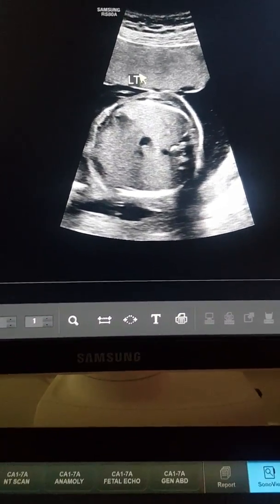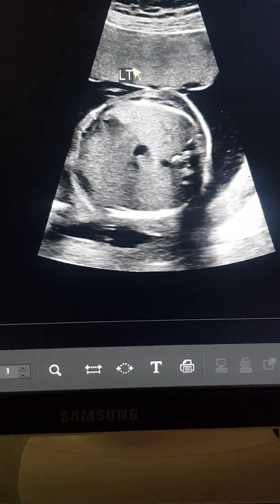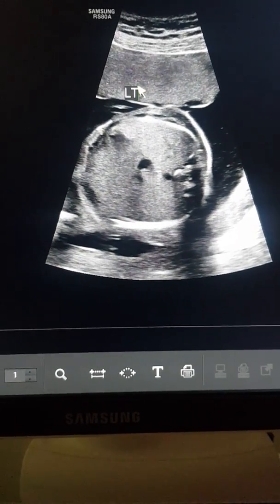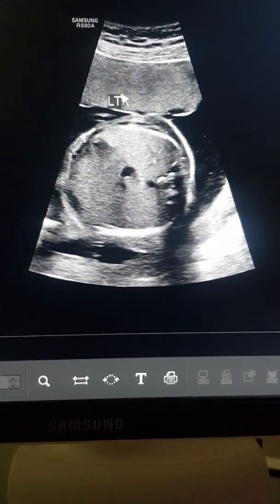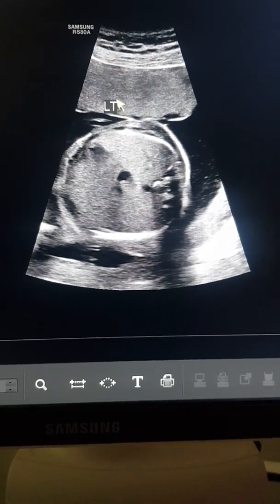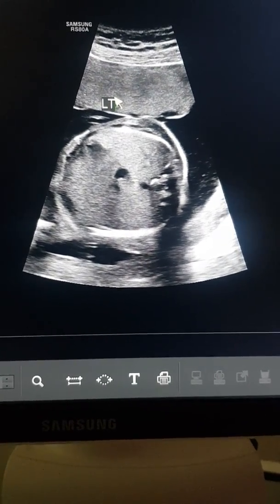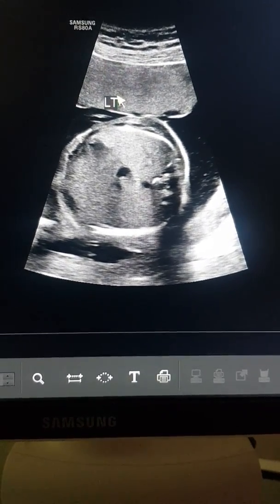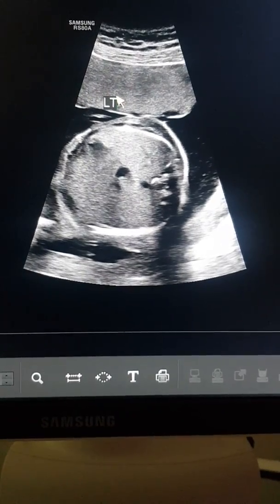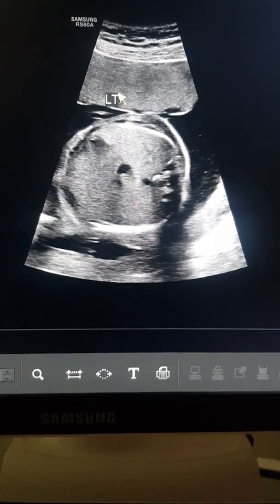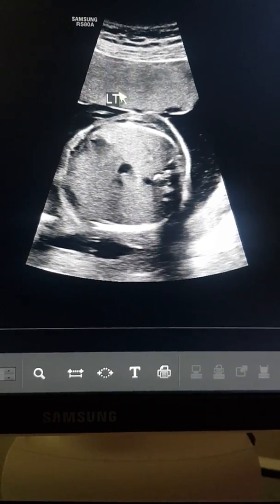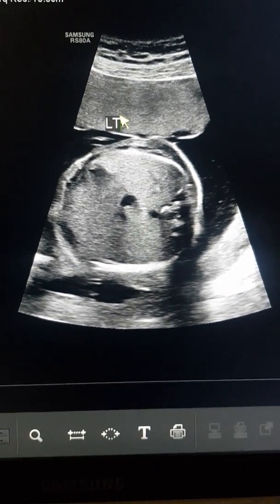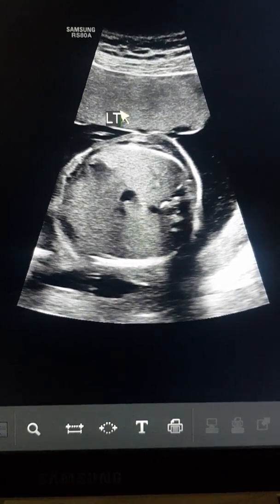Before we start the cardiac scan, the first scan to be done is of the abdomen. Here in this fetus, I have first determined which is the left side and which is the right side. This determination is done based on the lie of the fetus and position of the fetus in relation to the maternal uterus. First we mark the left side of the fetus which is anterior and then we try to see what are the organs on the left side.